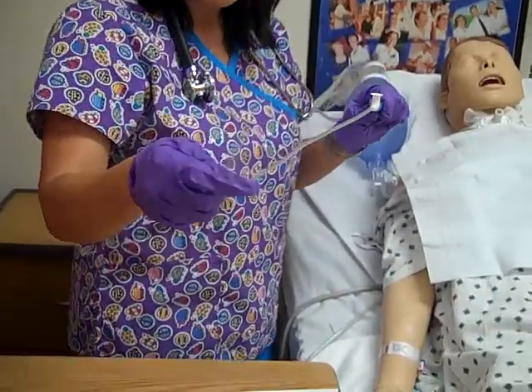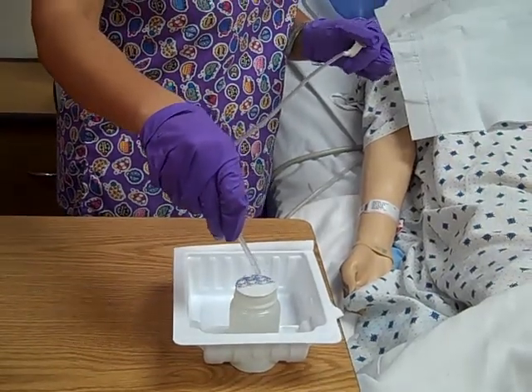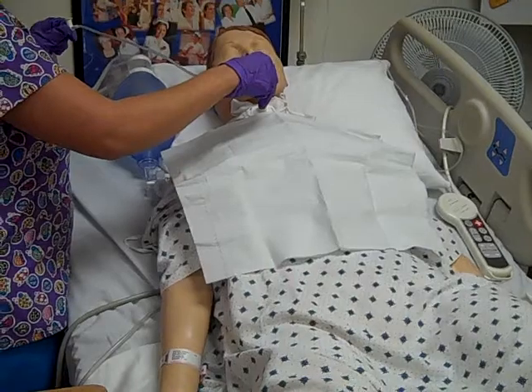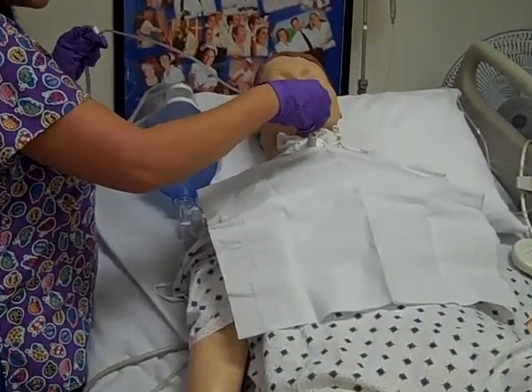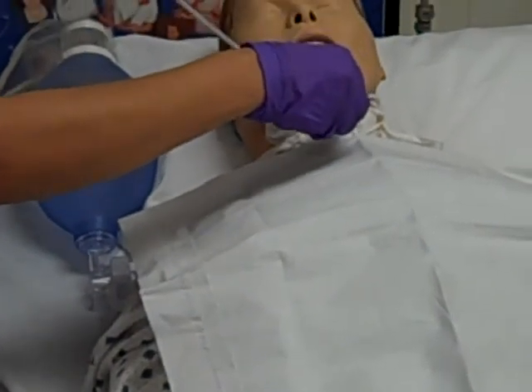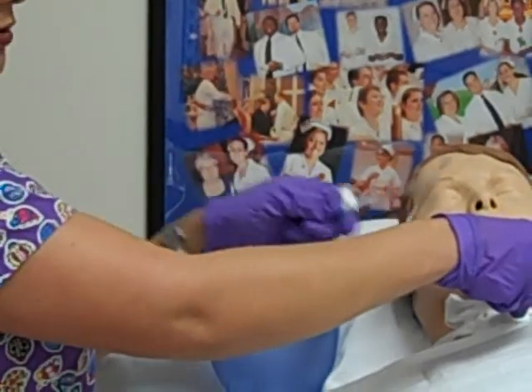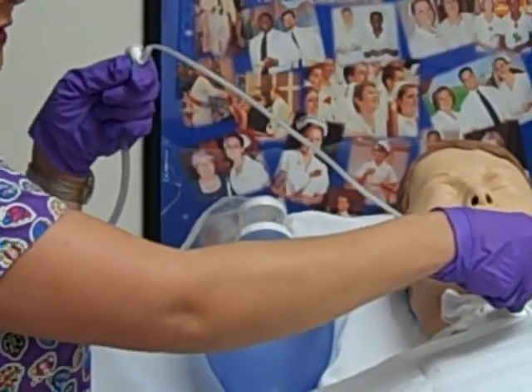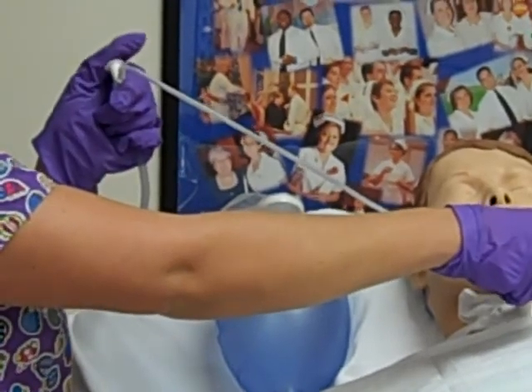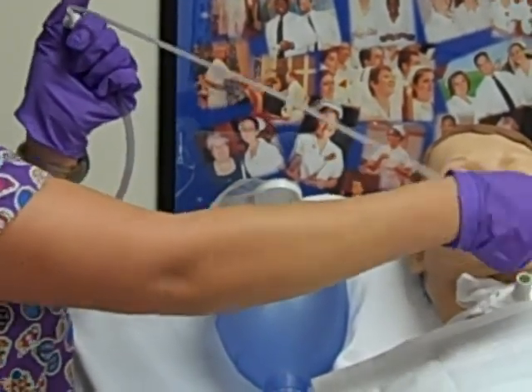Take my end, keeping the catheter taut, and I'm going to go ahead and test it to make sure that it's actually working. I'm going to go ahead and go in for the first time. I want to go in five inches or until I meet resistance. As I'm coming out, notice that I'm keeping my catheter taut so that I don't accidentally break the sterile field, and I also want to make sure that I intermittently suction on the way out. I want to do this no more than 15 seconds at a time.